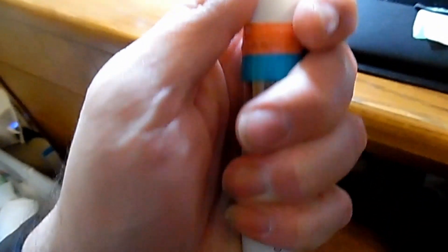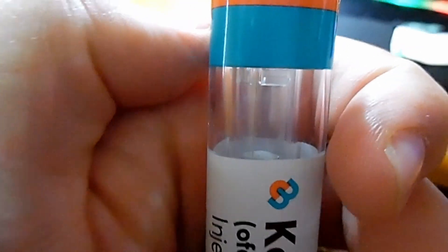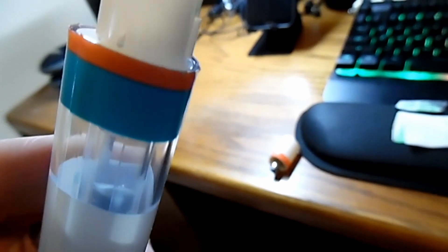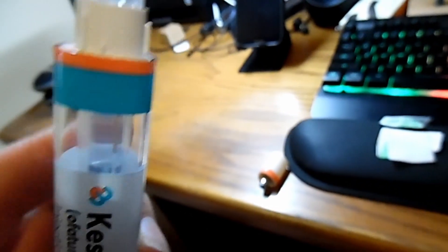Start by twisting off the cap. When you do that, it positions the mechanisms inside to be ready to inject you. The vial inside should be clear — nothing should be showing. That means it is ready.